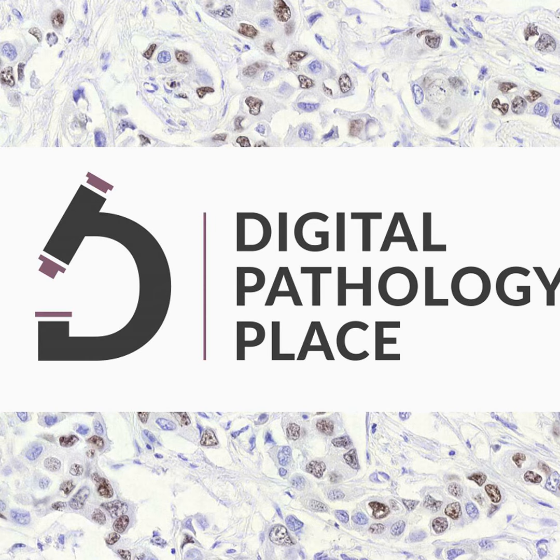So this is never a part of swarm learning. Going from features to prediction is the swarm learning aspect. Giving the feature to the model and getting a prediction out of it is where swarm learning comes into the picture, and training the model and making it better.